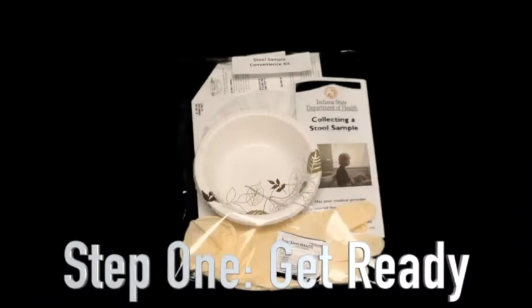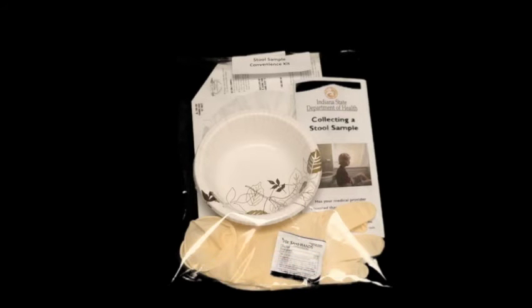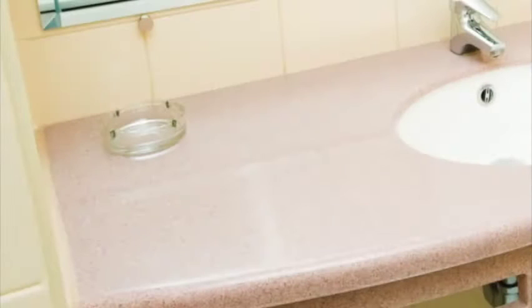Step 1: Get ready. Before you begin, let's make sure you have everything you need. Remember, you'll need to use a new kit for each person and for each sample contribution. Your stool sample convenience kit should include a cardboard and tissue paper liner, a paper bowl, gloves, and an alcohol cleaning pad.